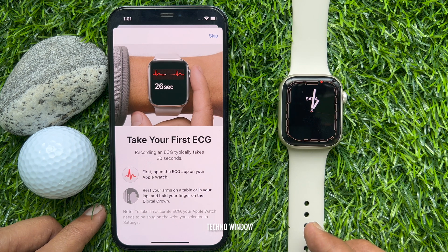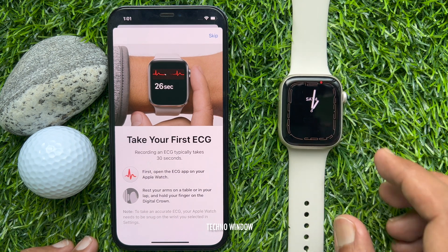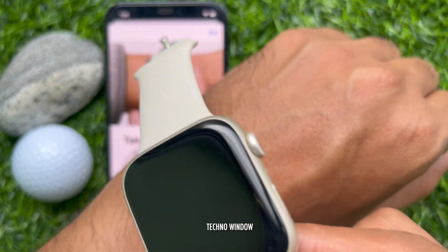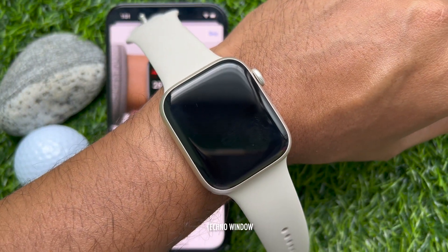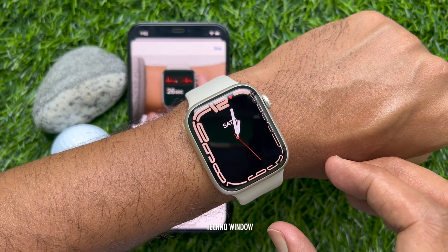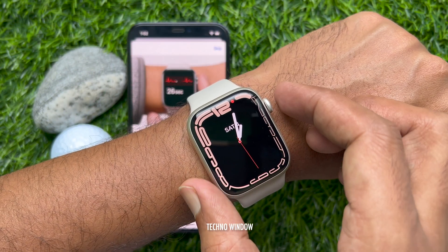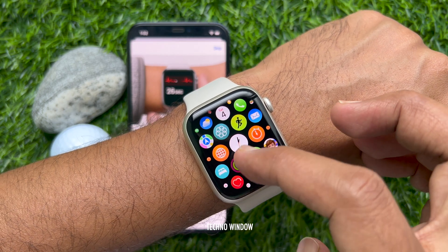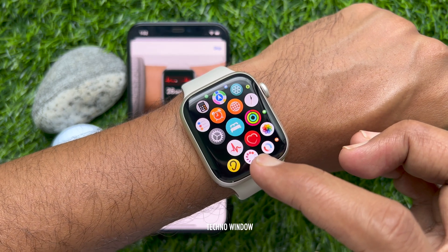First, open the ECG app on your Apple Watch. Then rest your arm on a table or in your lap and tap and hold your finger on the digital crown. Press the digital crown button to access the app screen, then scroll and tap the ECG app.